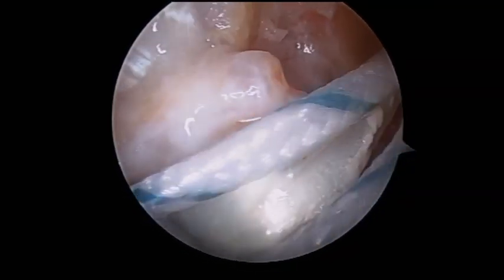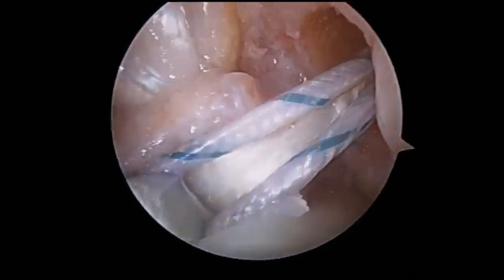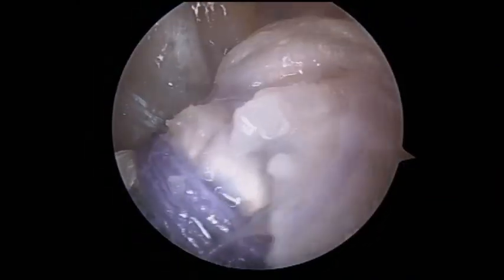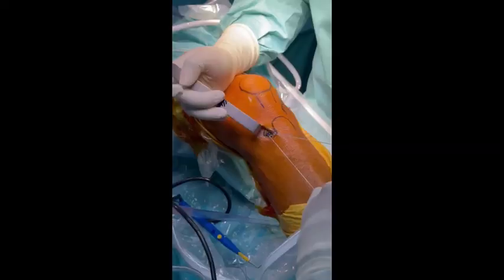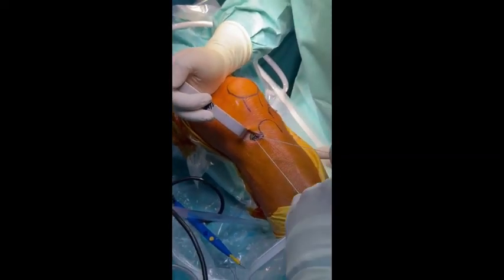Next, the femoral pull suture is tensioned to pull the graft up into the femoral tunnel. The tibial tensioning sutures are pulled until the graft and the button are seated in the tibial tunnel and cortical tibial bone.